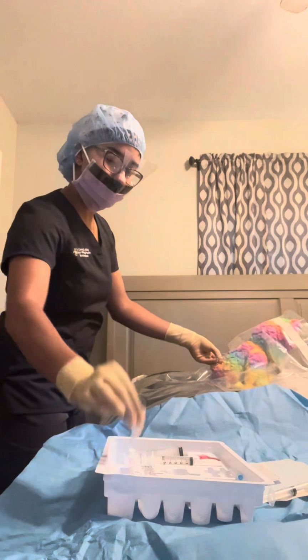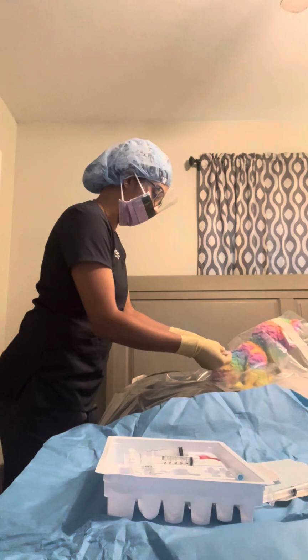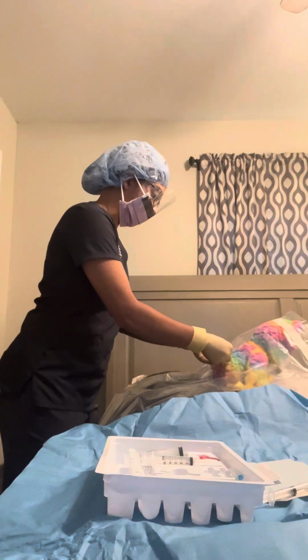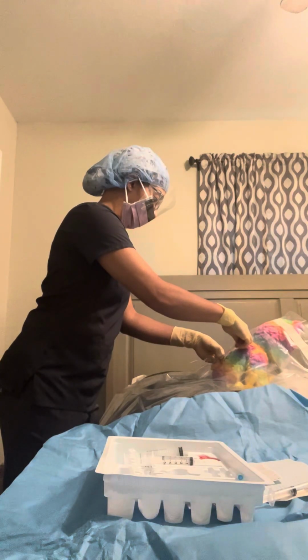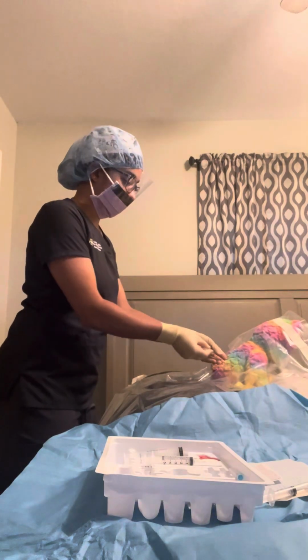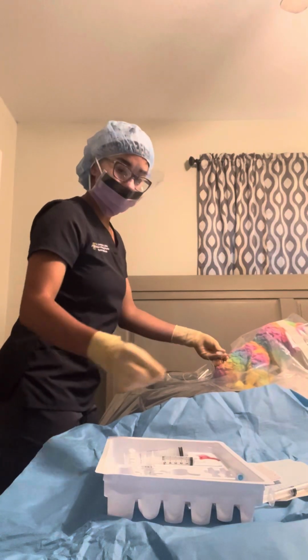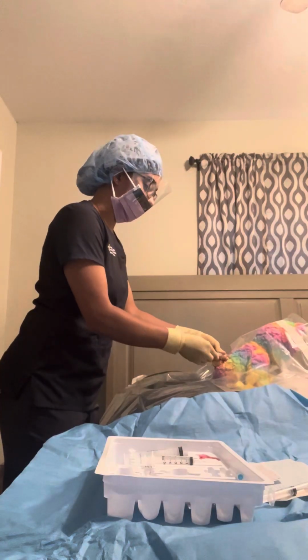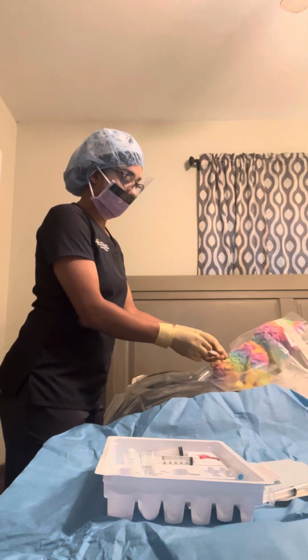Now I'm going to attach the adapter to the end of the catheter. I'm going to attach my filter to the end of the adapter, while still making sure the catheter does not move.